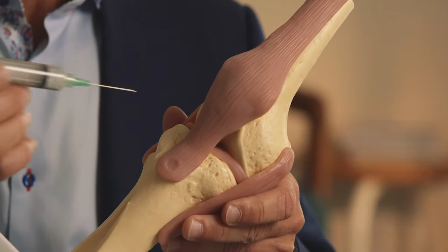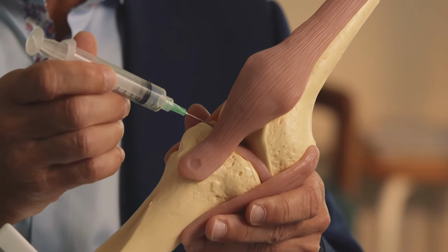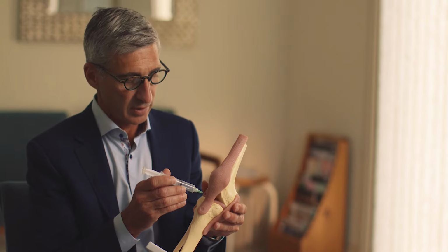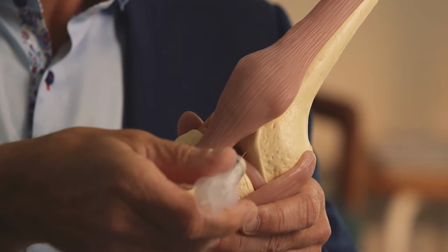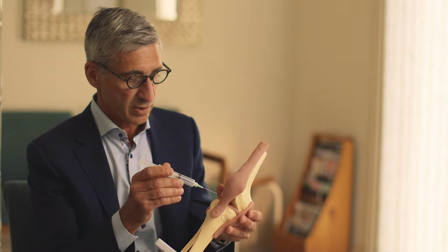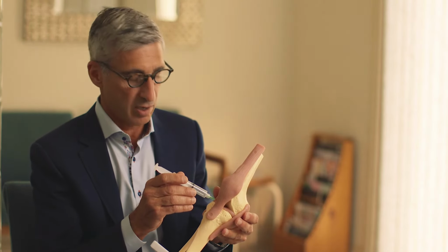I'm going to use this model to demonstrate the injection portals that are commonly used. The first would be the anteromedial and anterolateral injection portals. These are similar to what's used in arthroscopy. So just lateral to the patellar ligament in this direction is the anterolateral injection portal. And then the anteromedial injection portal here, just medial to the patellar ligament. These injections are directed back towards the intercondylar notch.